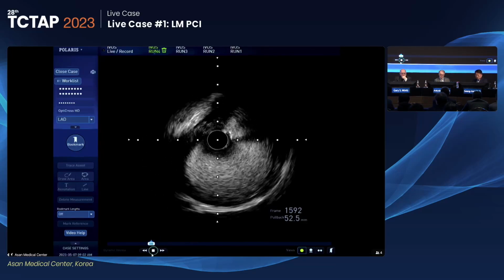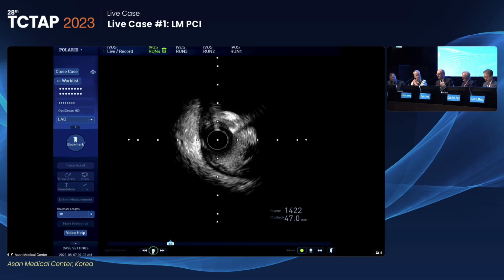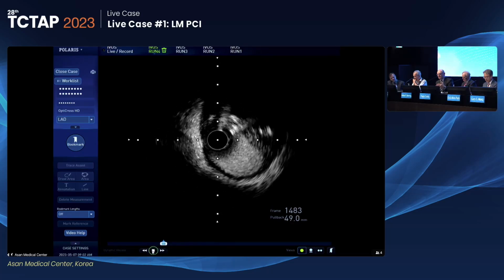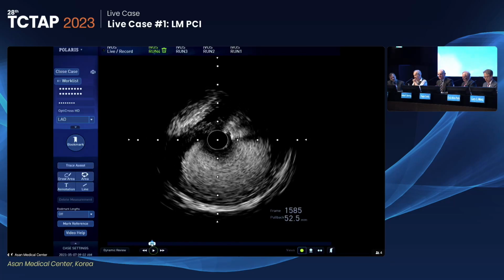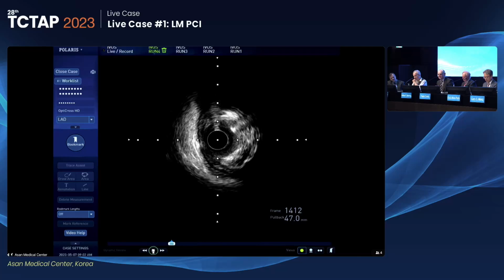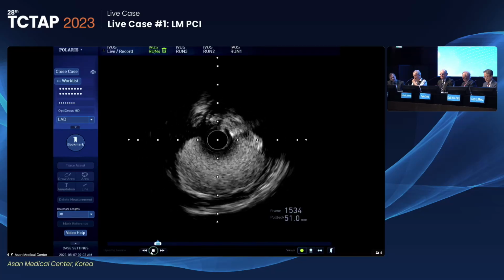But I think it is different, isn't it? The ostial and proximal LAD has been touched with balloons and intervened upon, so I would cover that. I'm not sure I would leave that now in a young guy like this. I think if we're going to put a stent in, let's cover all that diseased segment in the LAD. Yeah. So what is next, Dr.